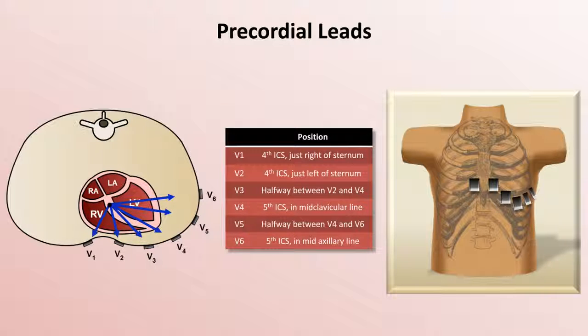The consequence of this, particularly when comparing a correctly recorded EKG to an incorrectly recorded one on the same patient but at a different time, will be an erroneous conclusion about the presence or absence of myocardial ischemia. This can lead to the inappropriate triage of someone with chest pain or possible anginal equivalent.